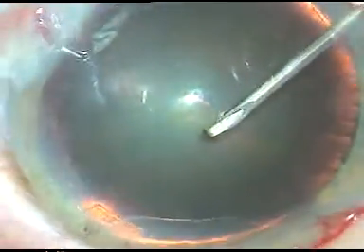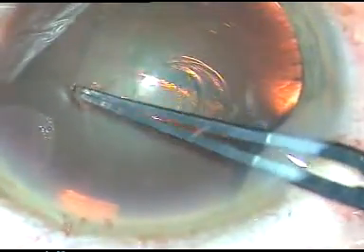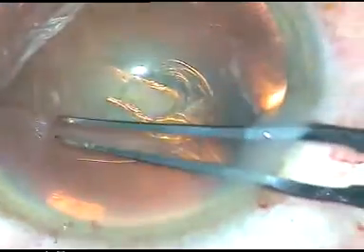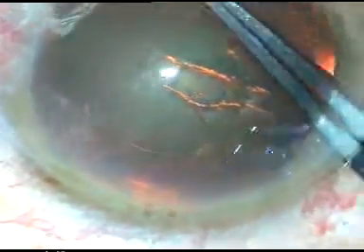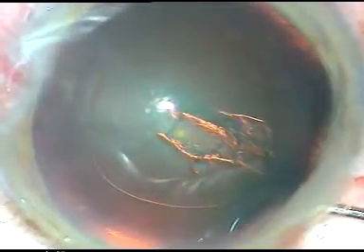Now this is capsulorhexis. The capsule has been incised and a nice flap has been raised. This is a utrata forceps — it holds this flap nicely. I move the utrata forceps anticlockwise and make a continuous curvilinear capsulorhexis of adequate size. The forceps rests against the anterior lip of the main incision and leakage of HPMC is minimal.